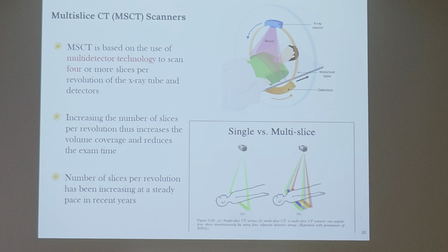Time. So if you're able to capture more under one slice, theoretically that saves time. And putting on my HR hat or my admin hat, saving time means patients move faster and more patients come in, and that's more revenue to support, right? Because x-rays cost money or they generate money. So if you say, I've only done my 6 scans today, I'm good, chances are no, your machine can do 60. So when you save time, that means you can do more.